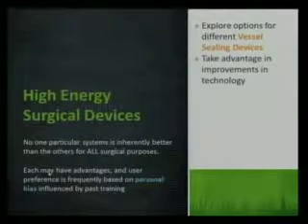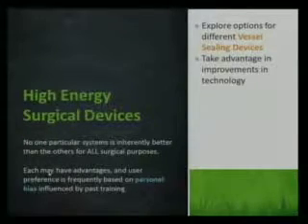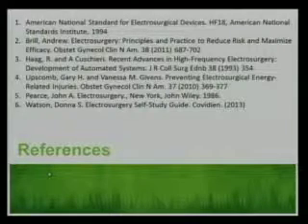That's why I always tell y'all, sometimes you put it on there and it goes forever, and for some reason it's not beeping, I tell y'all to pull it off because something's wrong in the circuit and it's not reading correctly. And some of those devices, you can hold them on there and it'll never beep, and you can take it off and the device got really hot. I've melted an end seal like that before. You have to be really careful. Does anybody have any questions?